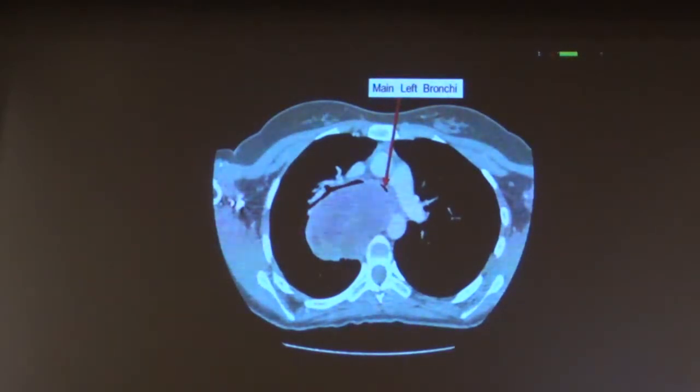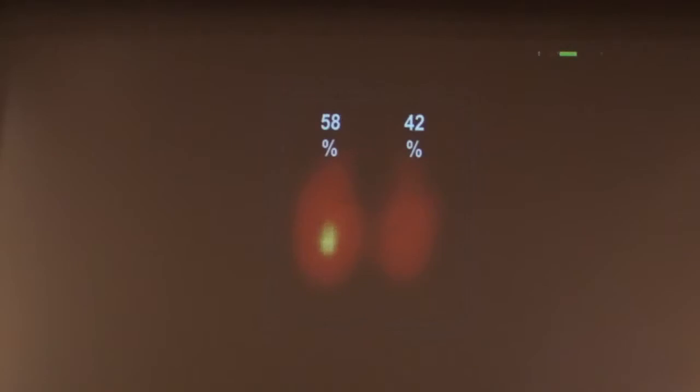This is a patient in our ICU, big mediastinal mass. So there was a big suspicion that this mass was blocking the main pulmonary artery. We did a perfusion study, and we had a very good bilateral perfusion. So, when we plotted this map on top of the ventilation map, you can see that then we could identify why this patient was so hypoxemic. This is why the patient entered the ICU.